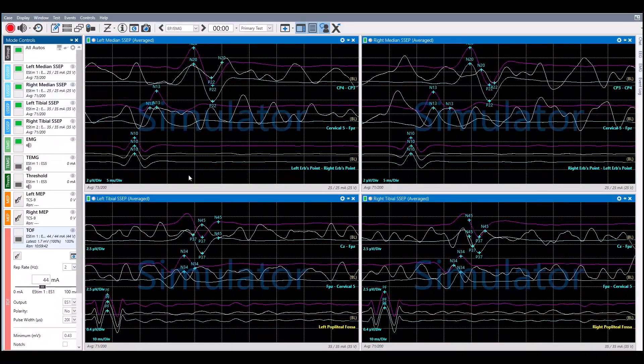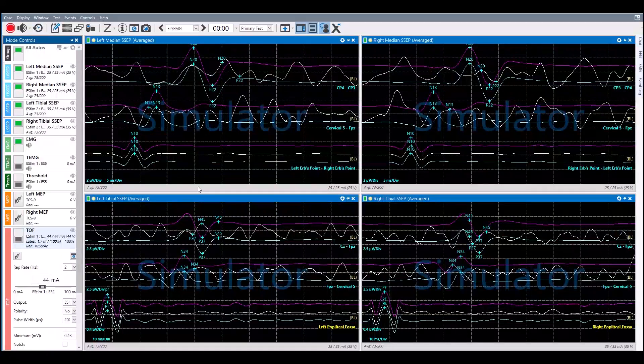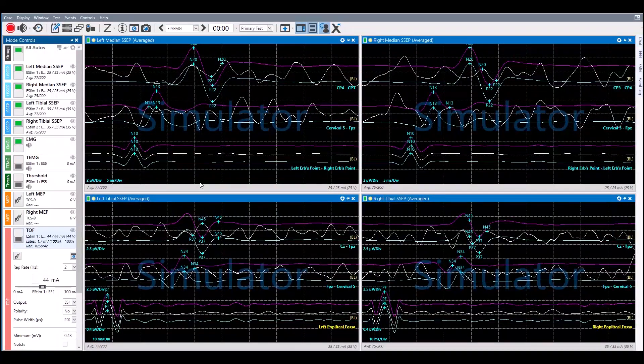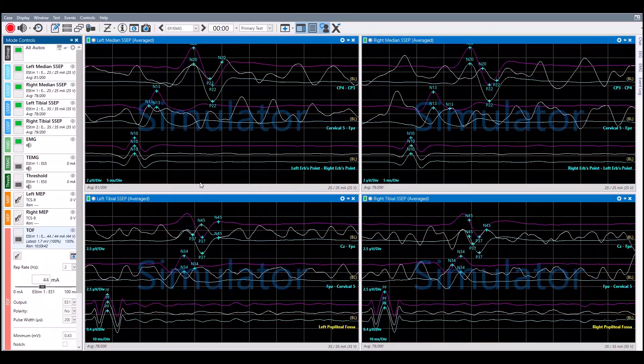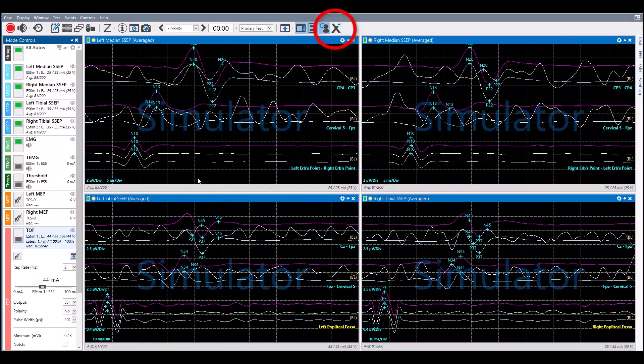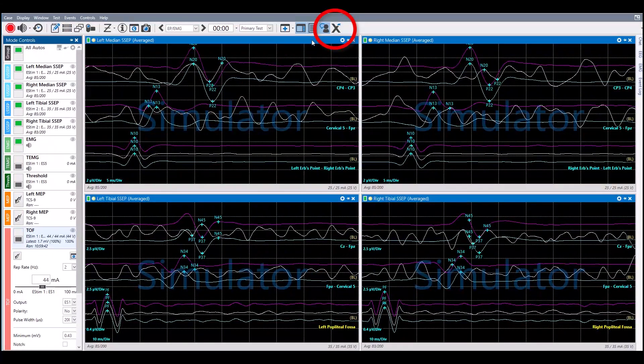Click on the Reset icon to set all impedances back to 1.0 kOhm.